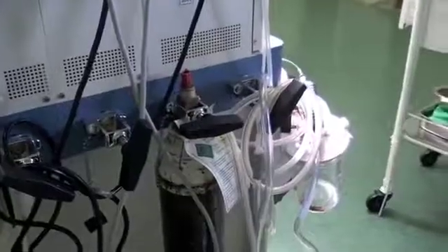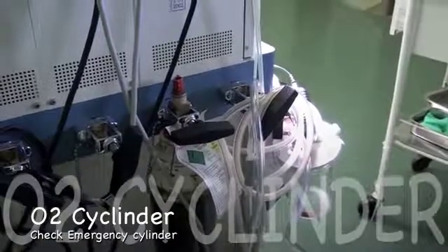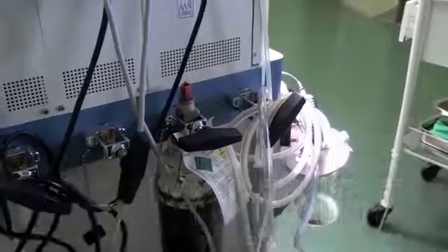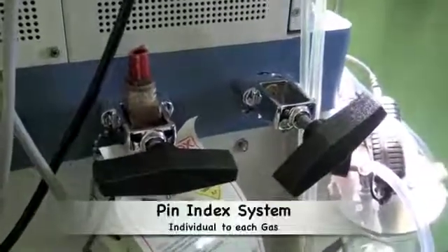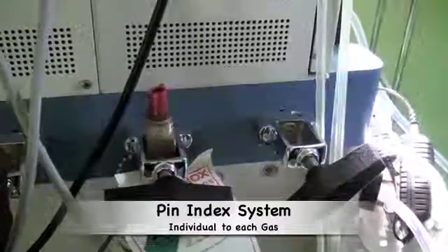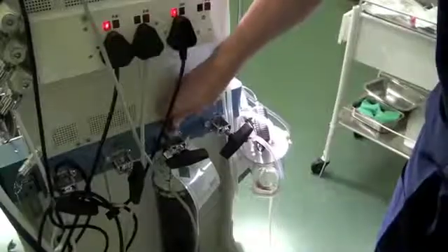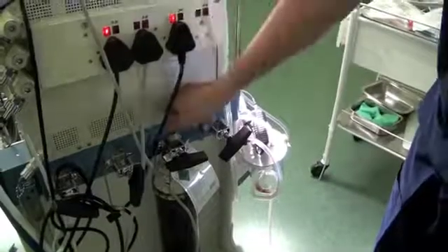At this stage, you check the emergency oxygen cylinder that must be located on the back of every anaesthetic machine. This too has an index system called the pin index system. Each type of gas has a different configuration of pins for the cylinder. When opening the emergency oxygen cylinder, one wants to ensure that it is seated correctly and that there are no leaks.